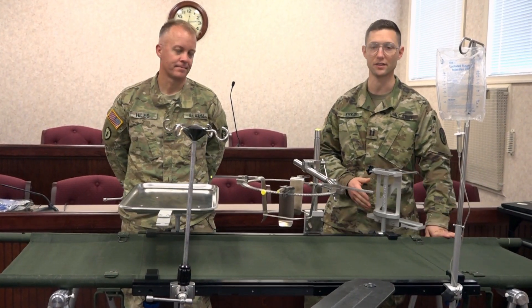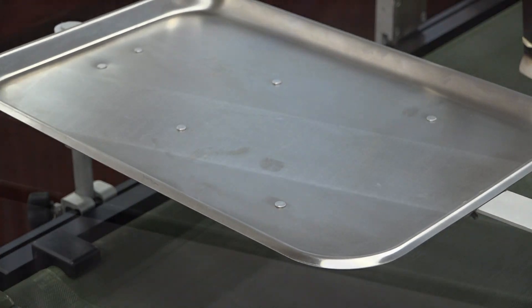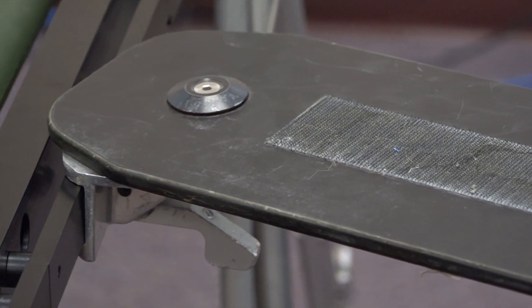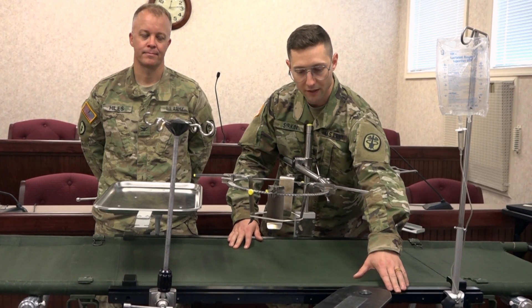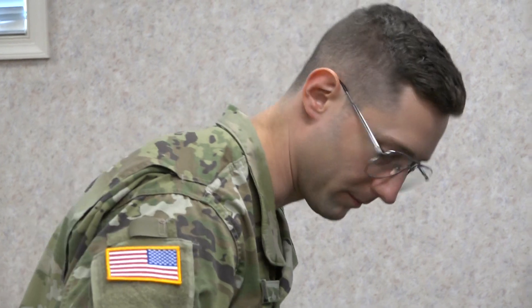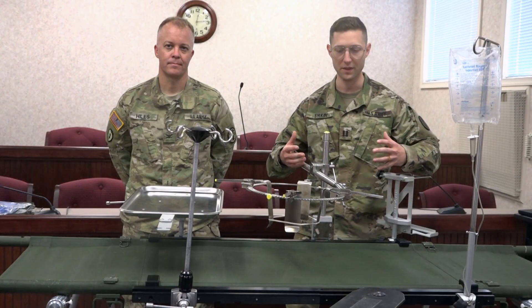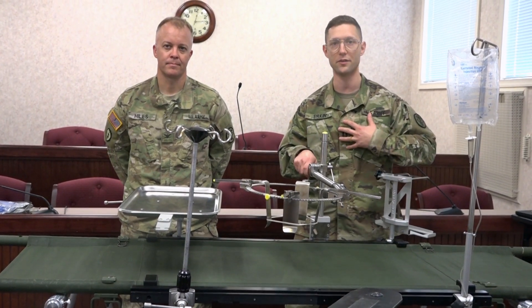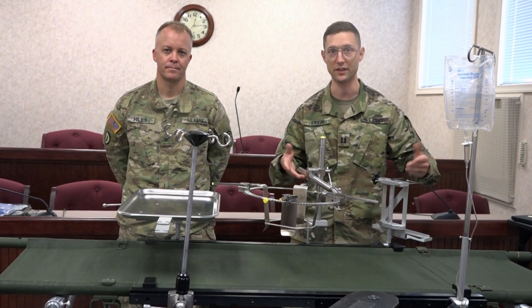In a matter of minutes, we were able to take a litter on litter stands and assemble it into a fully functional operating room table. All the attachments you see here come from multiple different sources, which is one of the major benefits of this rail system. This is a standard rail that comes from every OR in the Western world and can accept multiple different attachments from different manufacturers that are already in existence.